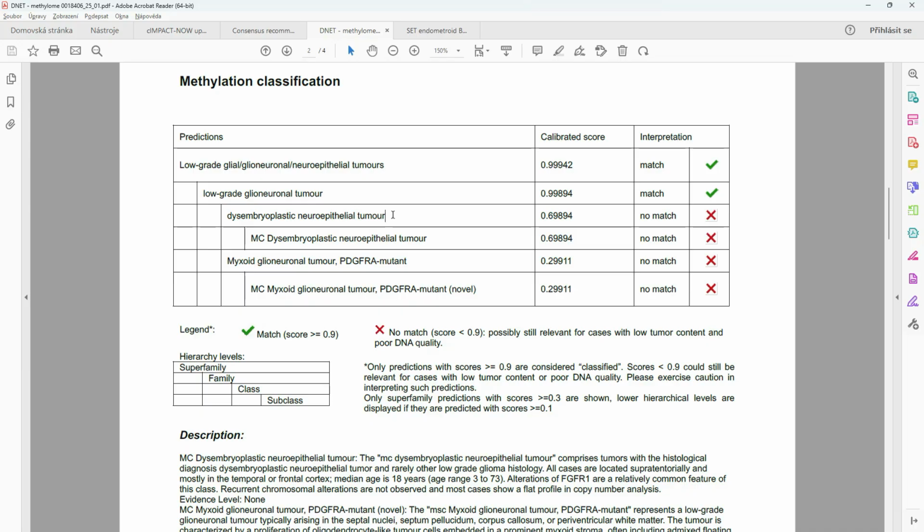And morphologically, it does not show the very typical specific neuronal component, which is diagnostic of the tumor, and rather shows an alternative or variant morphology, which is called diffuse morphology. Not everybody agrees with the histomorphology of this diffuse type, but I've seen 2 or 3 cases right now confirmed by molecular studies.